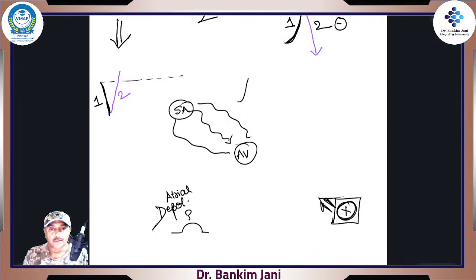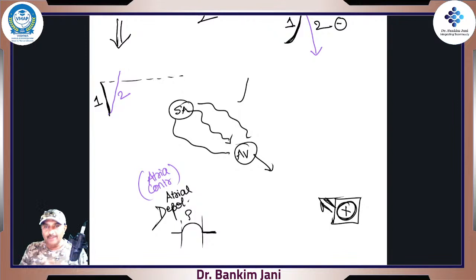Now there is one very beautiful thing that happens over here. Atrial depolarization occurs and then there is a spike because the current came towards that electrode. But now that current has reached the AV node, and the AV node is the only window, so the AV node is slow. The AV node holds that current. It will not immediately let it pass on to the bundle of His and everything. Why should it do that? Because when the atria contract, right atrium and left atrium both contract. Now there is a difference between electronics and the physical thing. Yes, it is a delay. Exactly, this is a delay.